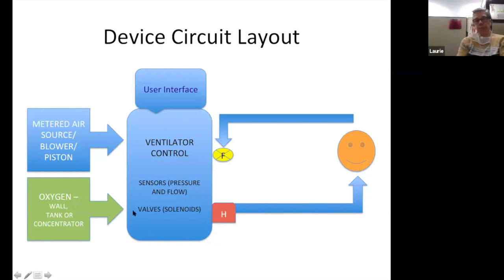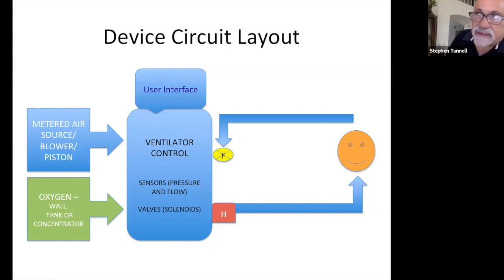Gas coming in here is dry, and without increasing the temperature and humidity of the gas, the patient who has their normal physiology bypassed will tend to have drying of the lung, drying of their secretions. In the worst case scenarios, casting, meaning fluid drying up and blocking the airway, creating obstructions.